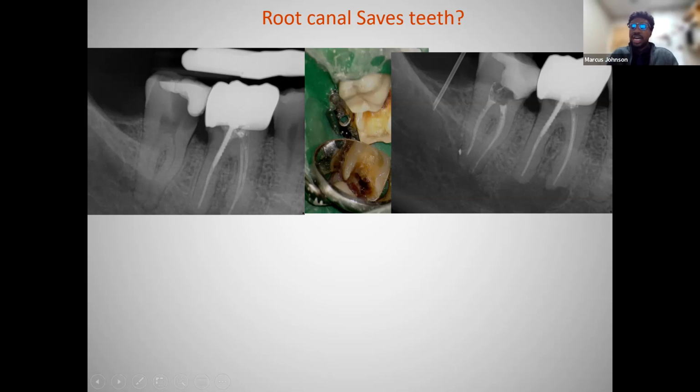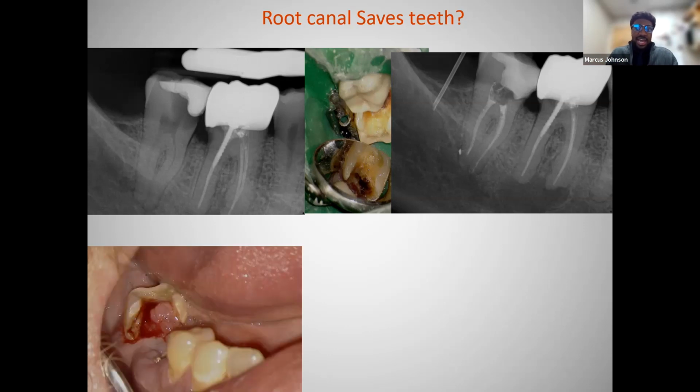Like I mentioned, it was an extremely hot tooth, so I had to use my intraosseous technique to get the patient fully anesthetized to achieve full pulpal anesthesia, and I'll touch on that technique a little bit later. But essentially, I love the recalls. Patient came back, and now I see this.